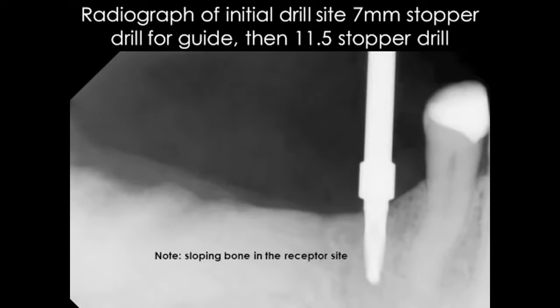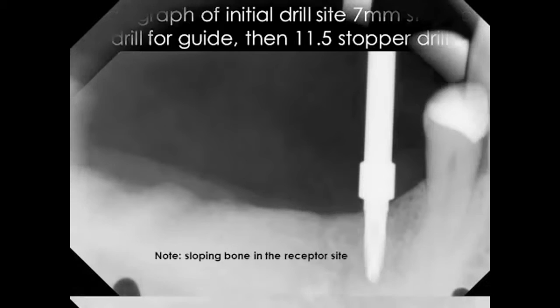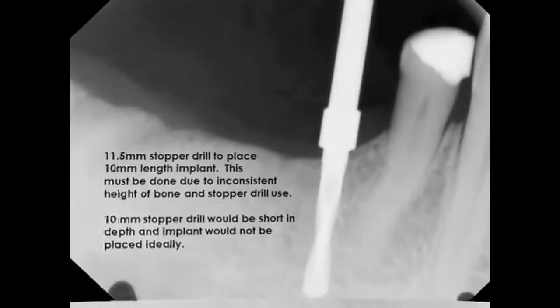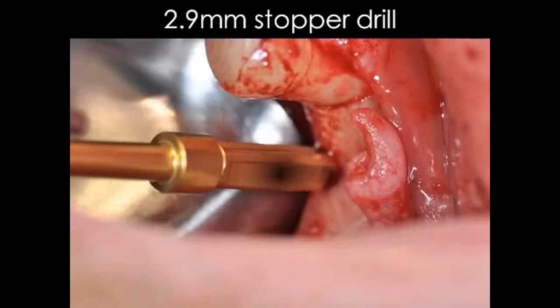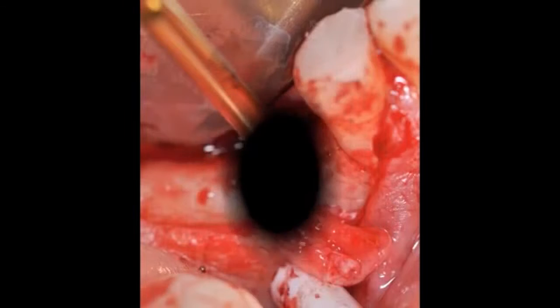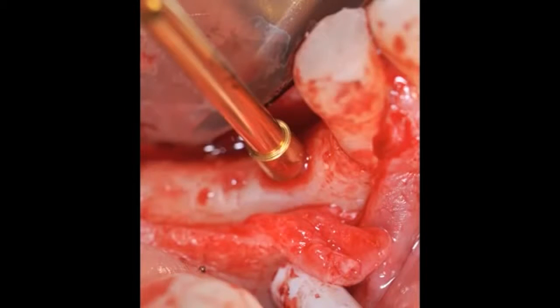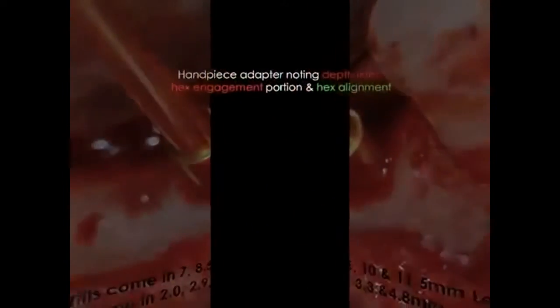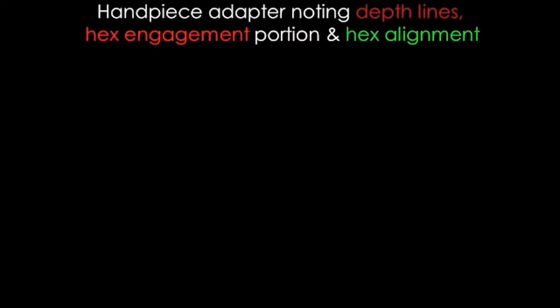However, you can note the bone in this particular area sloping upwards, and you can see where the stopper drill is not fully seating. So we had to over-prepare the osteotomy and utilize the 11.5 stopper drill to place a 10 millimeter implant to the proper depth that it needs to be. Next, you'll see the 2.9 stopper drill, again utilizing the 11.5 length, although we're only going to be placing the 10 millimeter length implant. But due to the sloping bone, we needed to use an 11.5 drill so that your implant platform will be at proper depth. Stopper drills do come in 7, 8.5, 10, and 11.5 lengths, and they do come in each diameter, which is very nice for the end user.